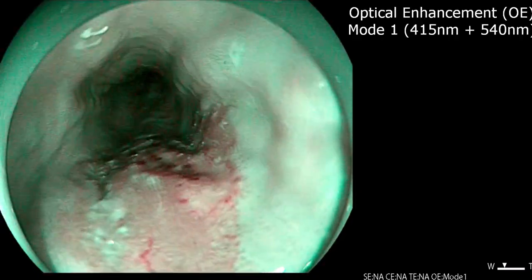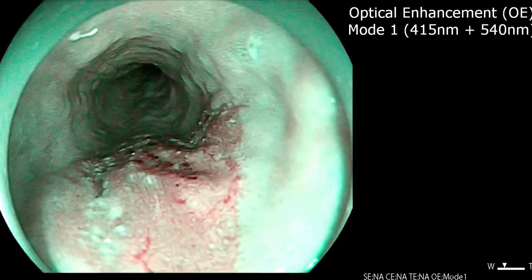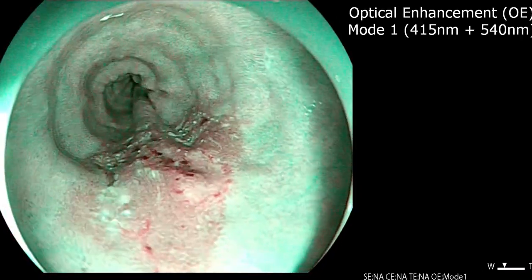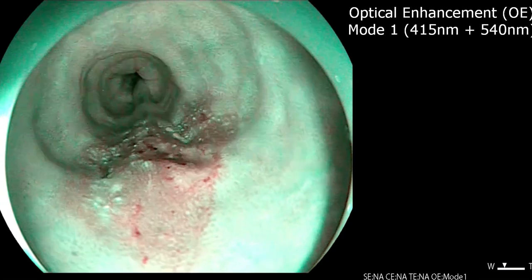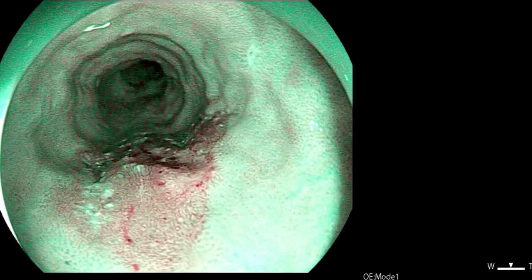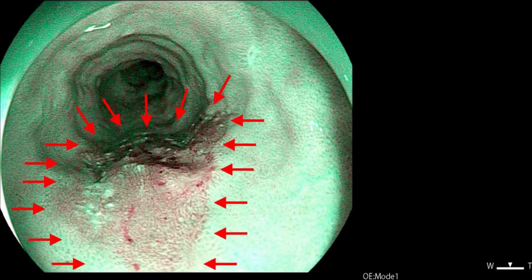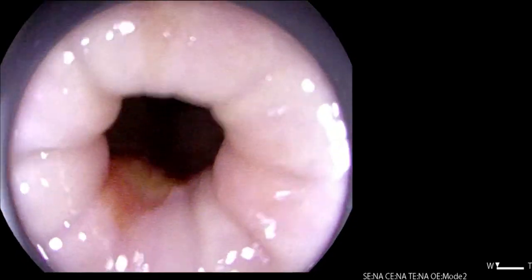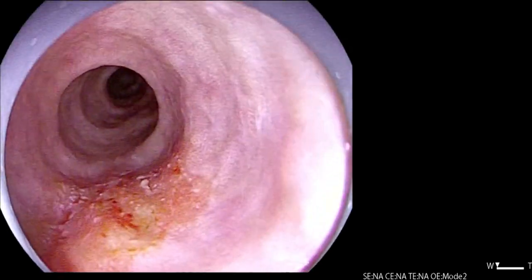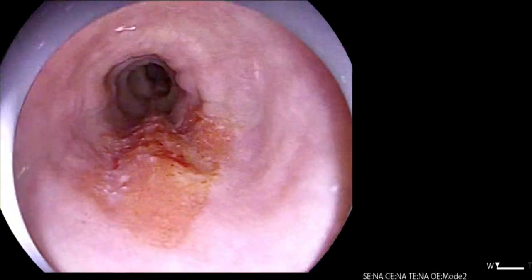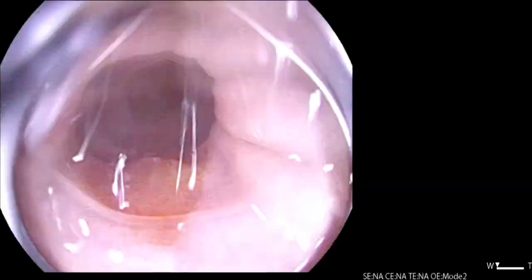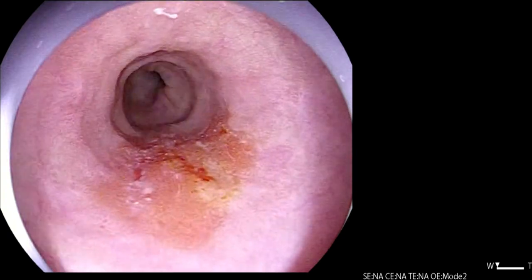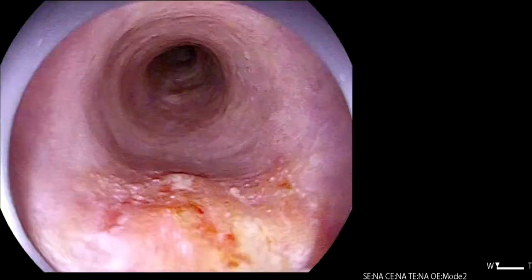The lesion is examined with Optical Enhancement Mode 1. As a result of highlighting the vasculature, the lesion appears darker than the normal background squamous mucosa. The lesion is then examined with Optical Enhancement Mode 2. Compared to standard white light endoscopy, the redness of the lesion and the delineation of the margins is enhanced.